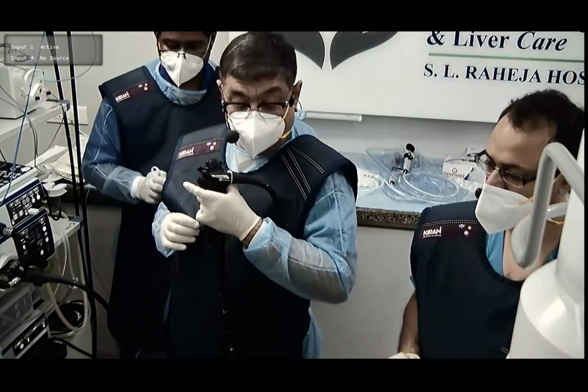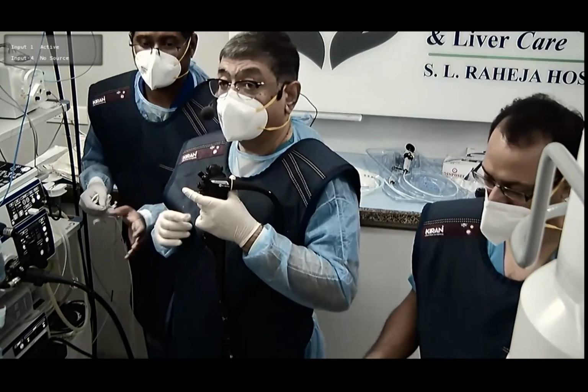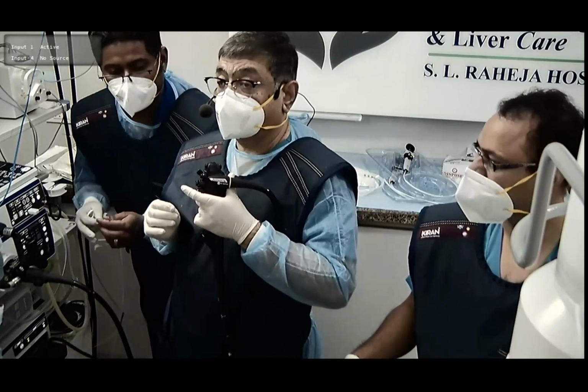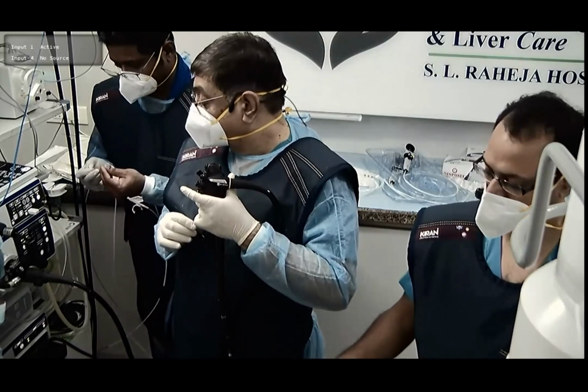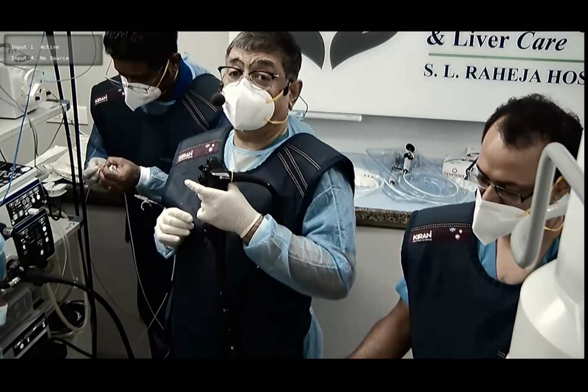Should I pull out more? You can pull out more. Take it. Yes. So now Bibin is threading a sphincterotome over this wire. You can see that.